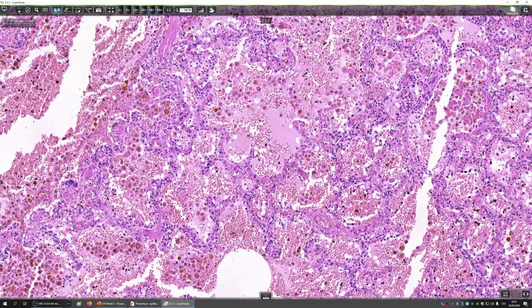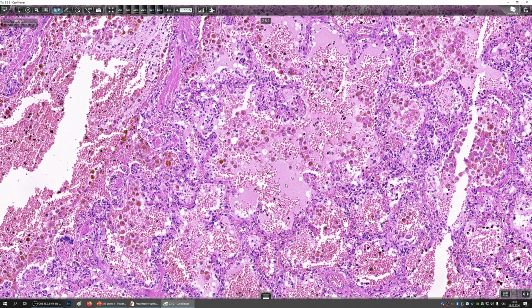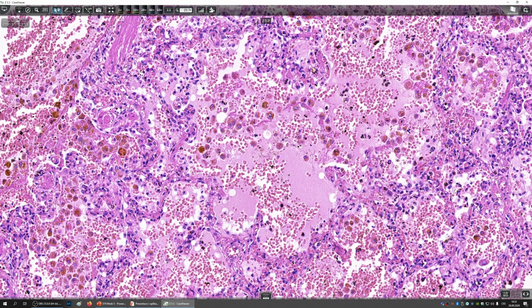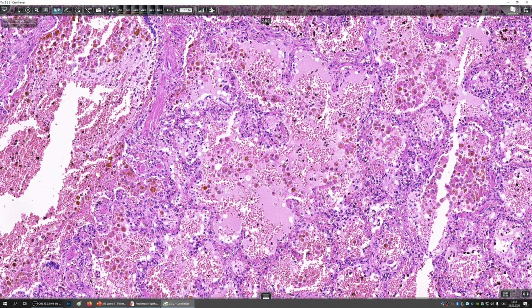So here we see once again the similar site of edema within the alveoli, but here additionally, besides the edema fluid, we have two more things. First thing, erythrocytes, lots of erythrocytes. So this patient already had very heavy heart failure. As I've told you, if you have a chronic venostasis within the lung, then the erythrocytes get pushed through the capillary wall into the alveolar spaces.